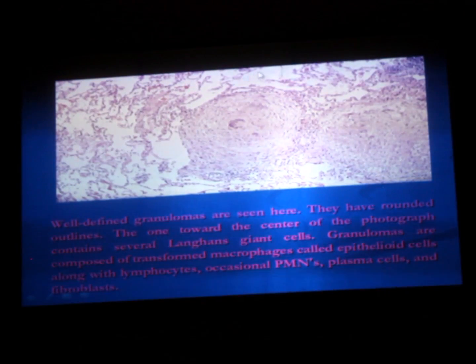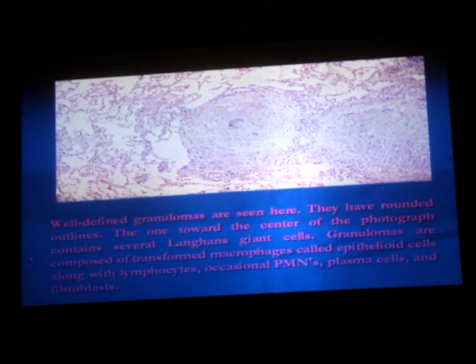This is lung tissue containing alveoli. So first identify the organ. Okay, this is lung. Now this is not emphysema because we are seeing some big round structures. This is not lobar pneumonia because there is no exudate or inflammation. So this can be pulmonary tuberculosis. Like that you should write. Only 3 slides for lung. Either it will be emphysema or TB or lobar pneumonia.